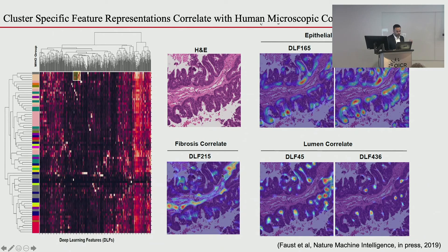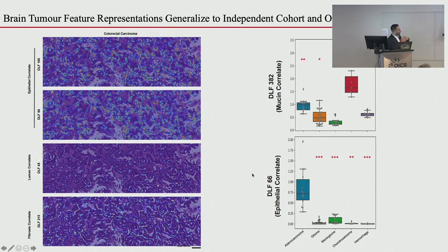Feature 215 — our fibrosis correlate — labels the fibrous stroma associated with the tumor, not the epithelium or luminal structures. These features generalize well: even though these examples were from 500-micron tiles, the patterns are preserved across much larger areas of tissue and whole slides. Features 66 and 165 label the epithelium cleanly, the lumen feature labels the lumen cleanly, and the fibrosis feature labels fibrous stroma — all without hand-selected areas, clean throughout the whole slide.